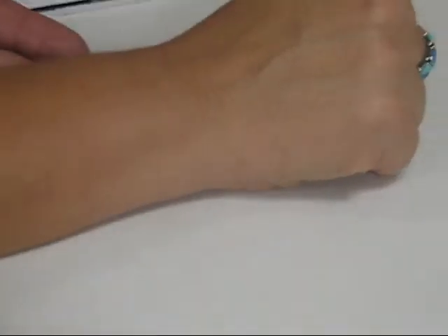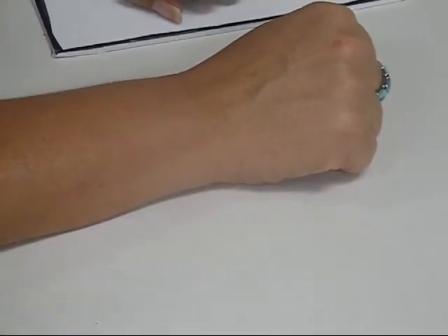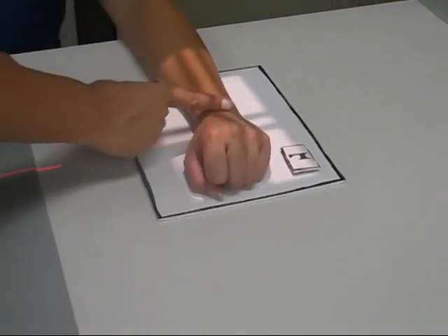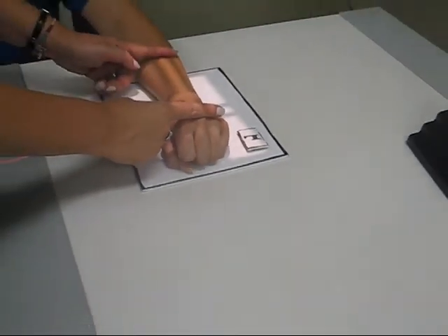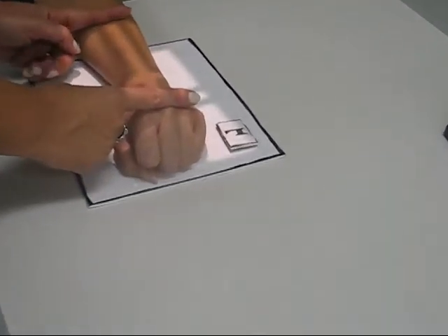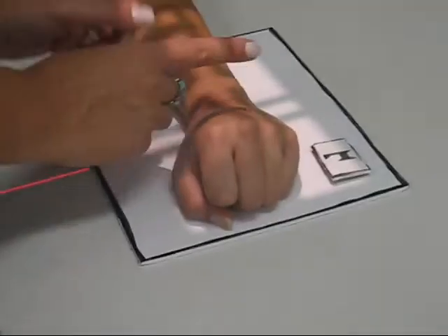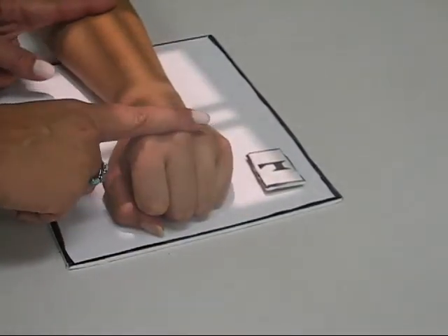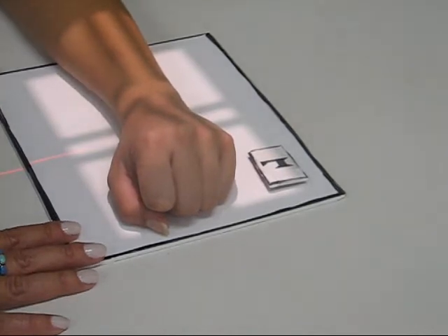For the best contact, 100% contact with the image receptor. So you want to get a little bit of the hand, at least the metacarpals, and a little more of the forearm, but don't collimate too much, because the structures on either side of the joint need to be visible, okay? And pretty much from that is really easy.